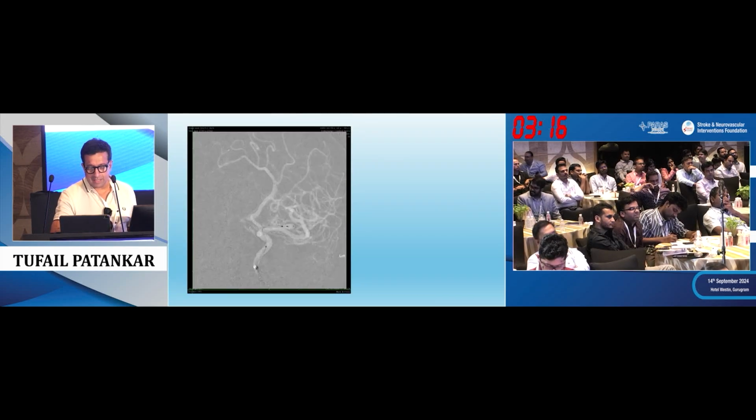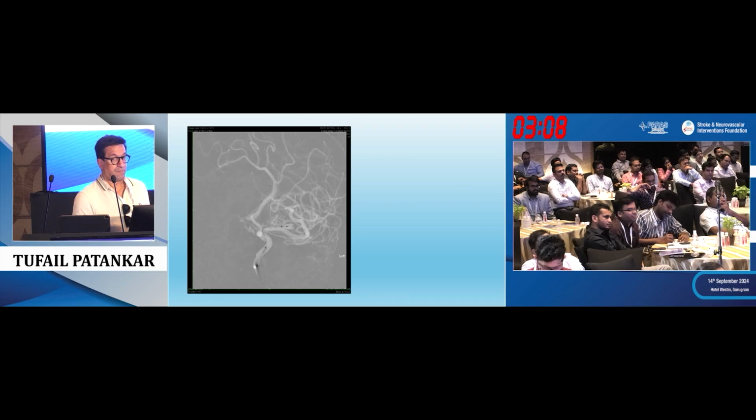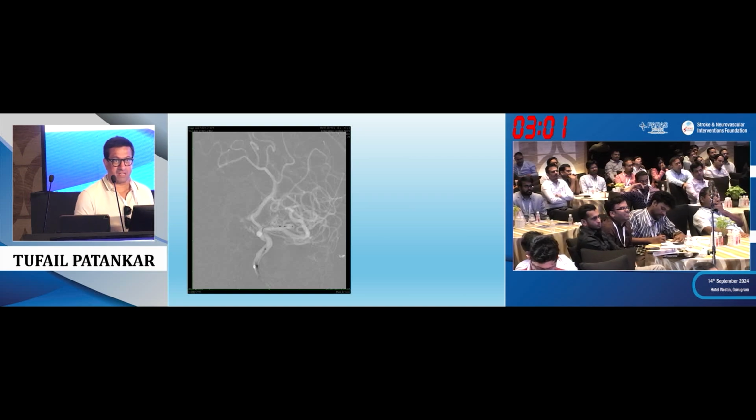Okay. And here you can see now I have played with the device, and I'm going to bring the device a little bit back. It's a bit forward. I always want to make sure, because I'm always competing with the surgeons, and the surgeons don't like these small neck recurrences in UK for some reason.